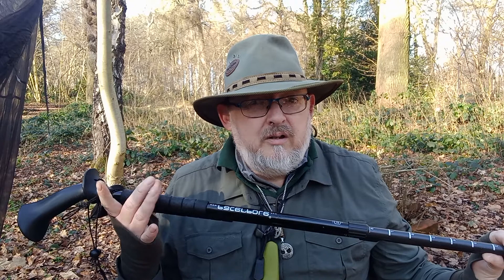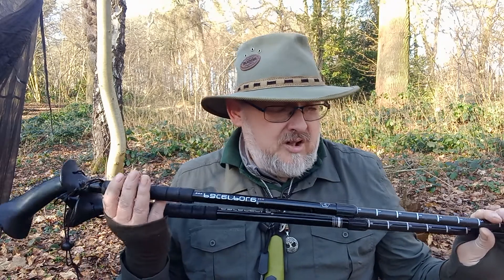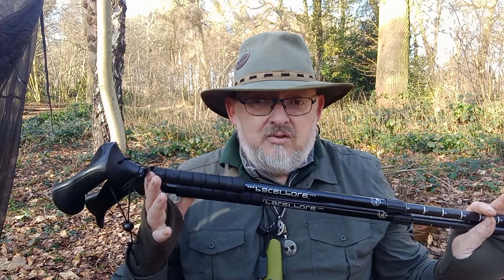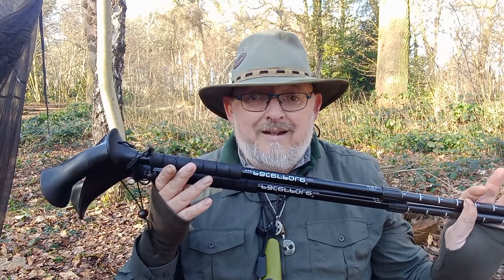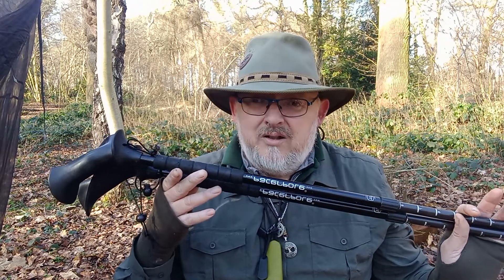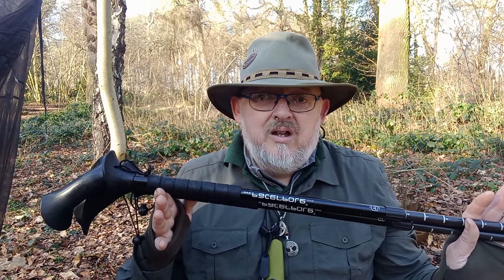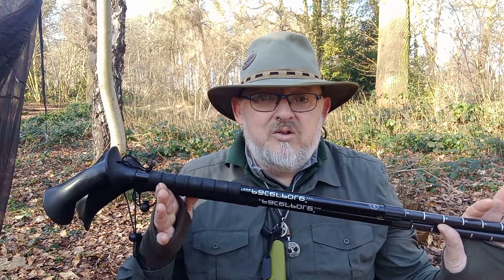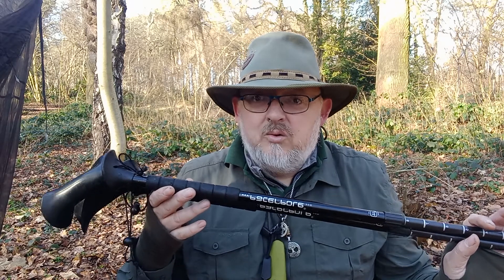I've been out in minus temperatures without gloves using the neoprene covers, and in the rain, and it's kept my hands toasty. When I bought these they were about 70-odd quid, and that was nine years ago so I'm not sure what they cost now. Chris Townsend from The Great Outdoors magazine uses these all the time and has done a couple of reviews on them — he can't fault them either, and he's been using them longer than I have.